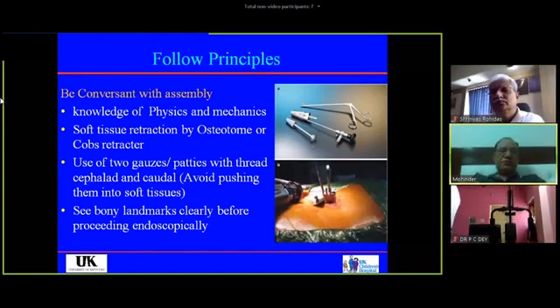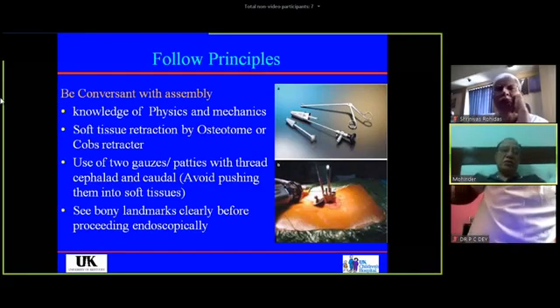Number one, the first frustration for a surgeon, which most of my colleagues share with me, is that they are not able to see anything inside because there is a lot of muscle coming into the view already.